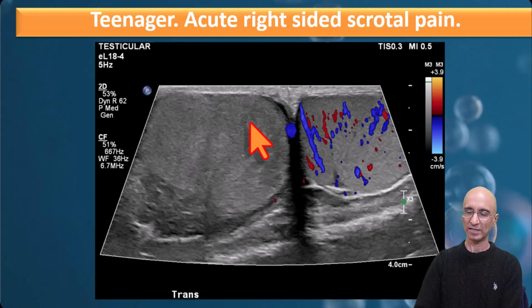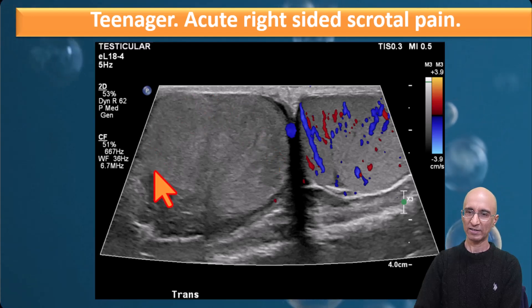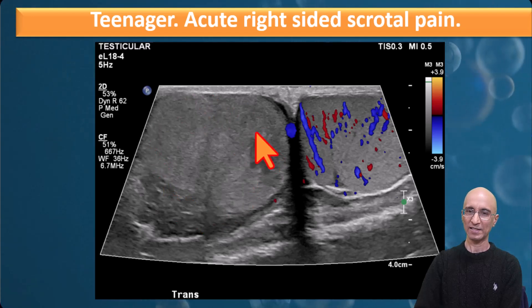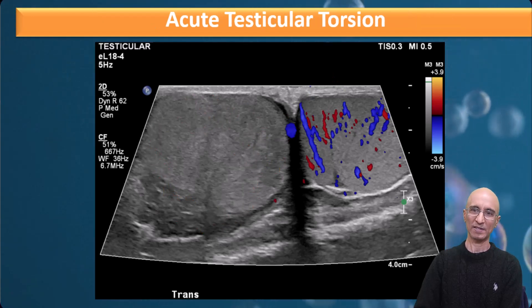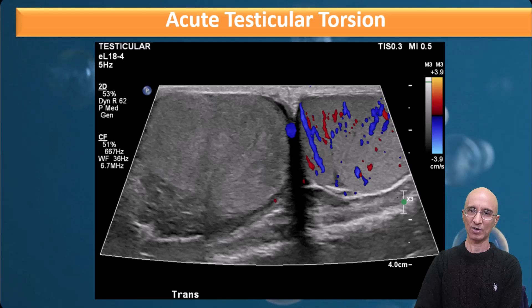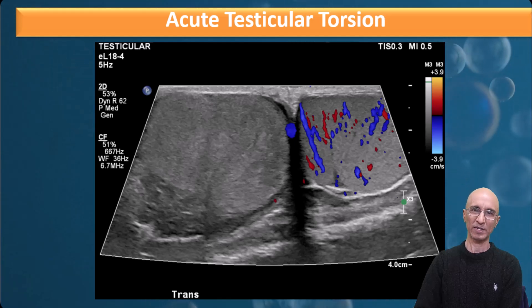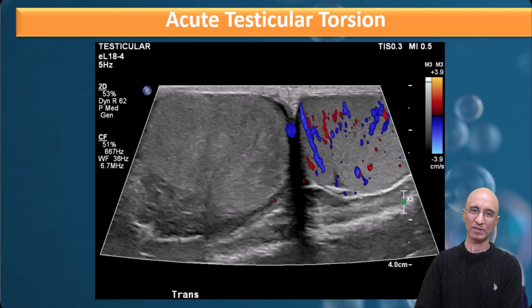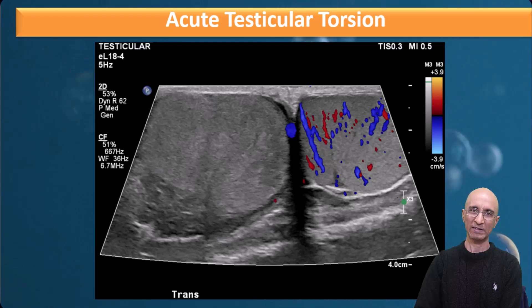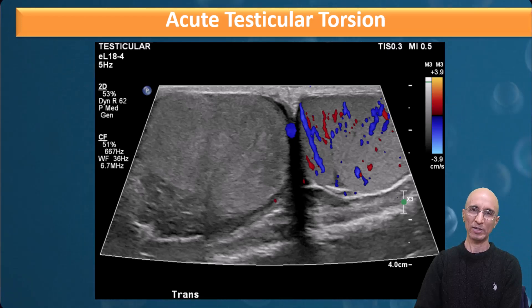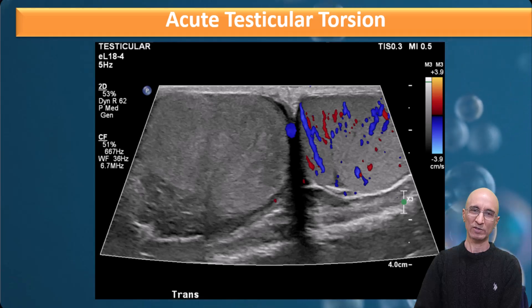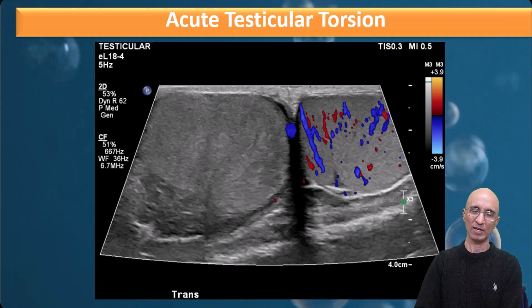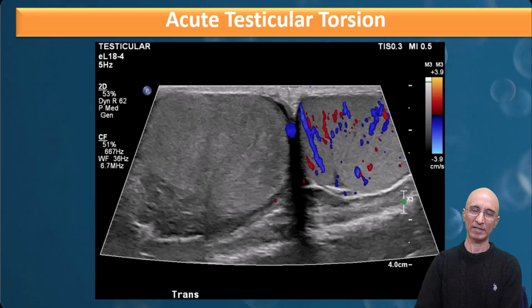Our patient has an enlarged right testicle without vascularity. Imaging appearances are consistent with acute testicular torsion. The patient was taken to the OR and the findings were confirmed — there was approximately 360-degree torsion of the spermatic cord. Upon detorsion, blood flow was restored to the testicle. The patient underwent bilateral orchidopexy.